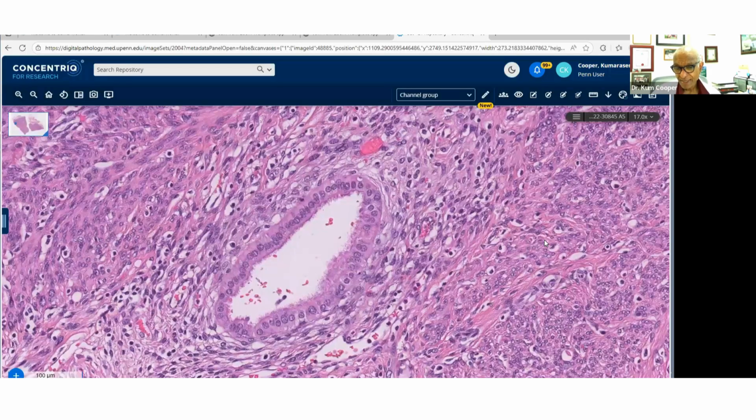You don't necessarily get those sort of phyllodes-like patterns, so you could debate that as well. Remember the phyllodes-like pattern that we see in the breast. That's the kind of pattern you want to see in adenosarcoma, right? So you may debate, I want to see that in adenomyoma as well. So it's benign to me in both the components.